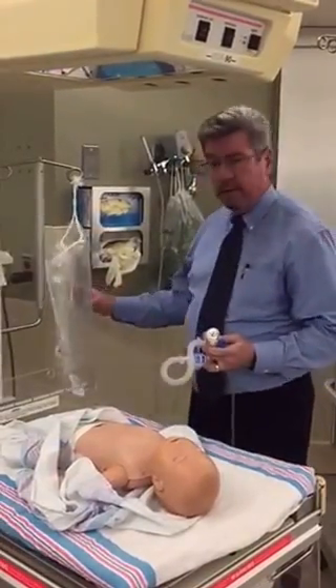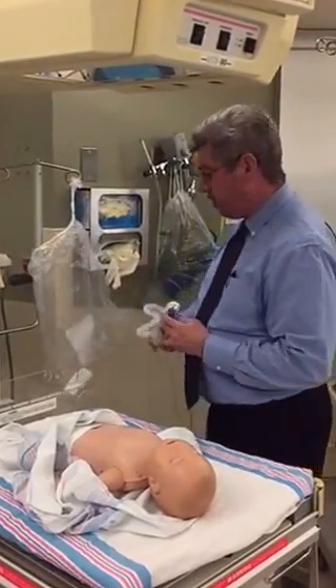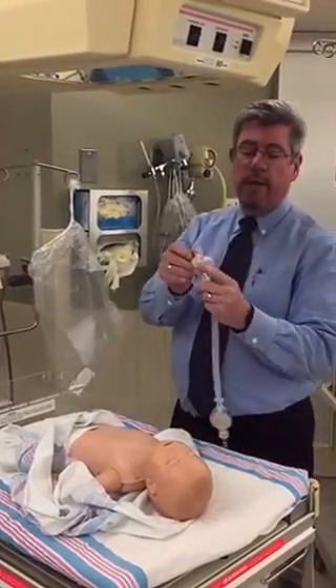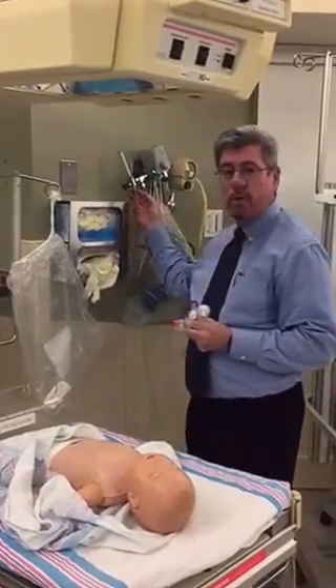It's going to come similar to like an Ambu or CPR bag. We are going to take it out of the bag — it is going to have a cover sealing it up, and it's also going to come with a mask in the bag. What we're going to do before we put the mask on is we're going to attach it to our flow meter.